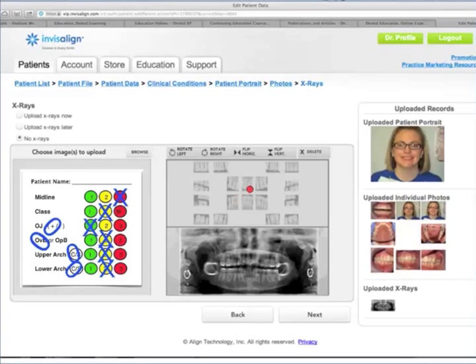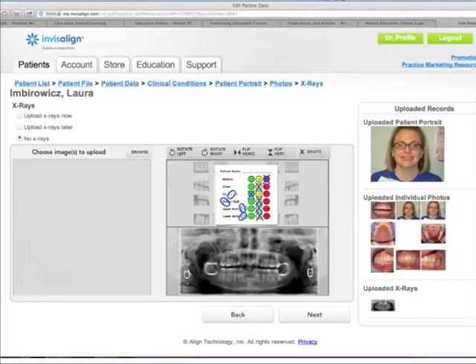Rather than uploading a second x-ray, you will import the photograph you took of your template and then just simply drag it across, and the prescription form will recognize that, and that will go directly to your technician. So that prescription grid is your communication tool for unpacking all of Dr. Brandt's expertise into your ClinCheck and getting that information right to your technician.